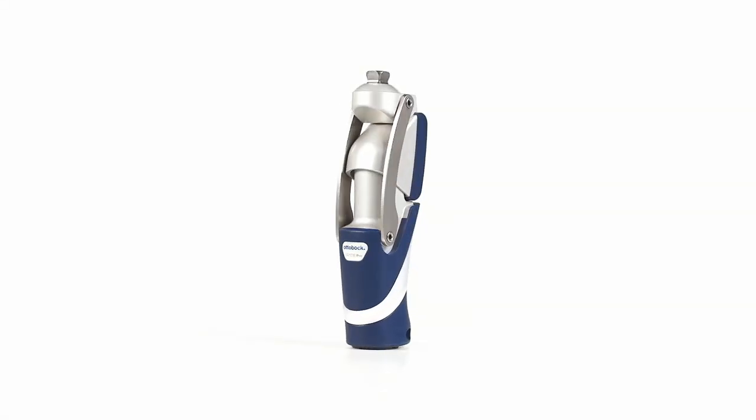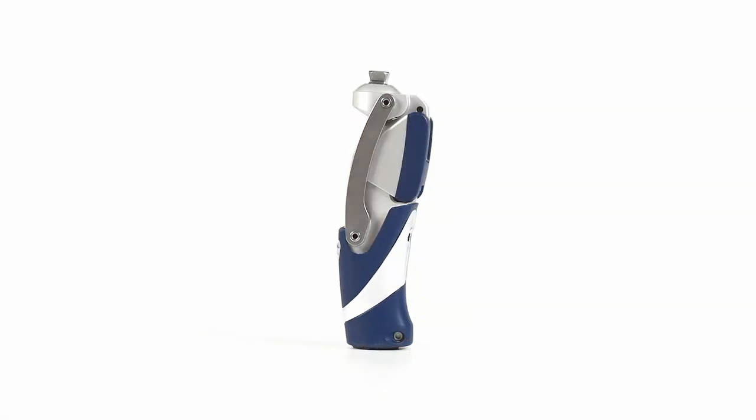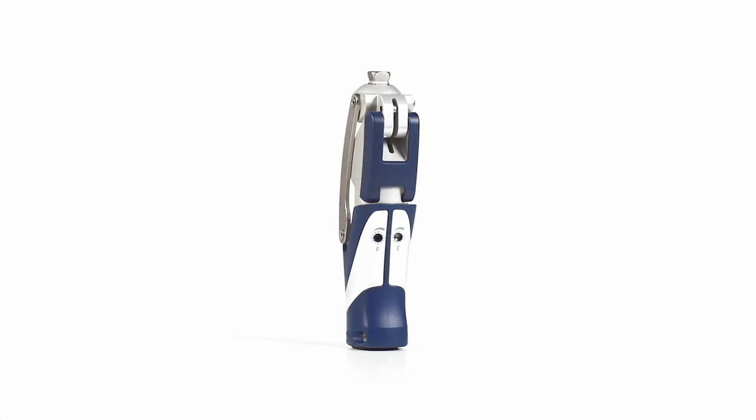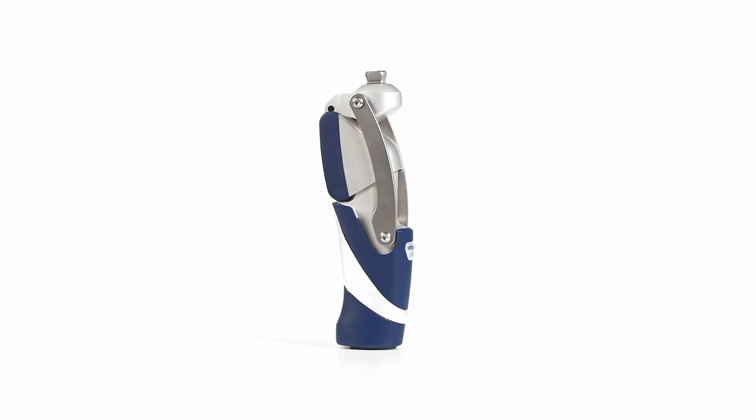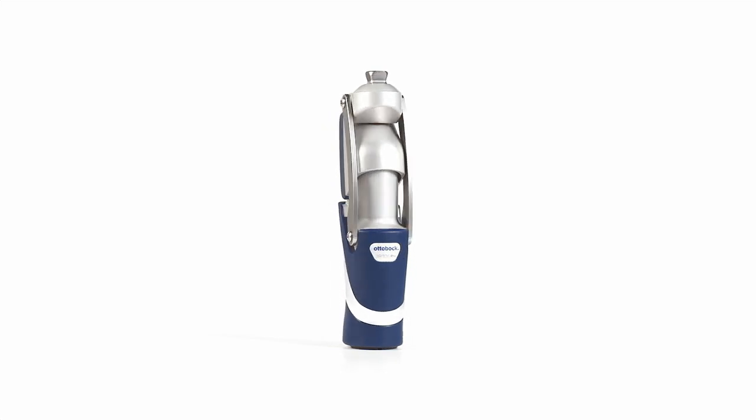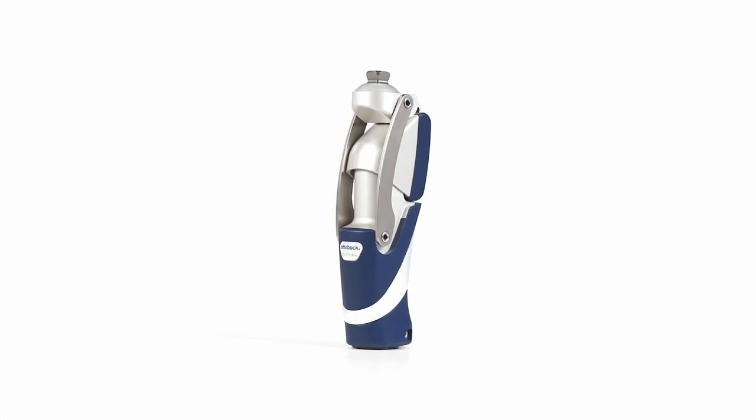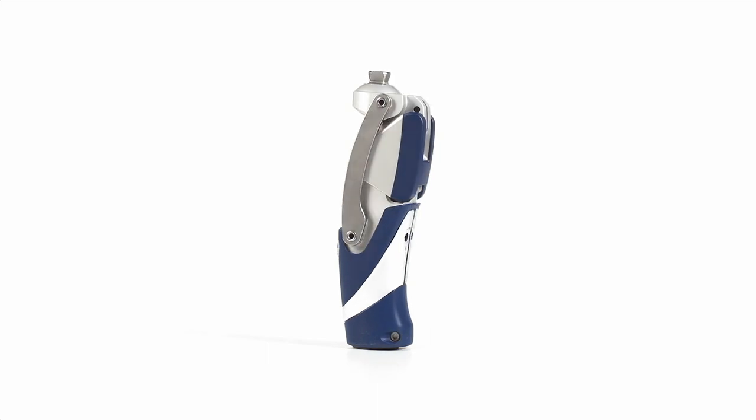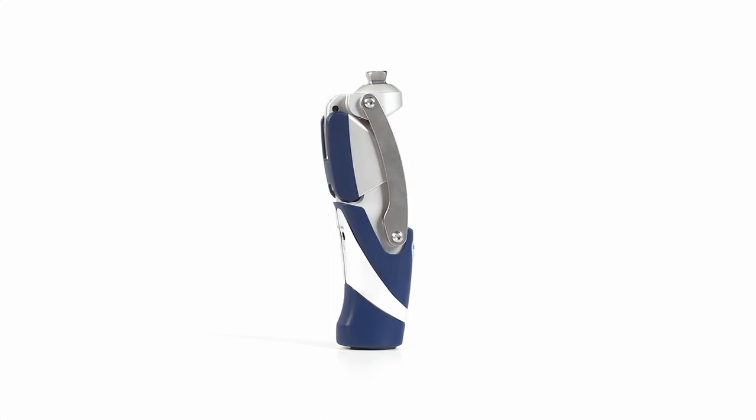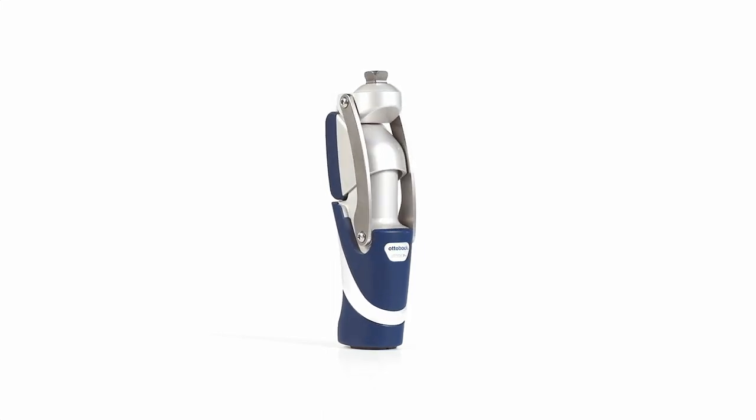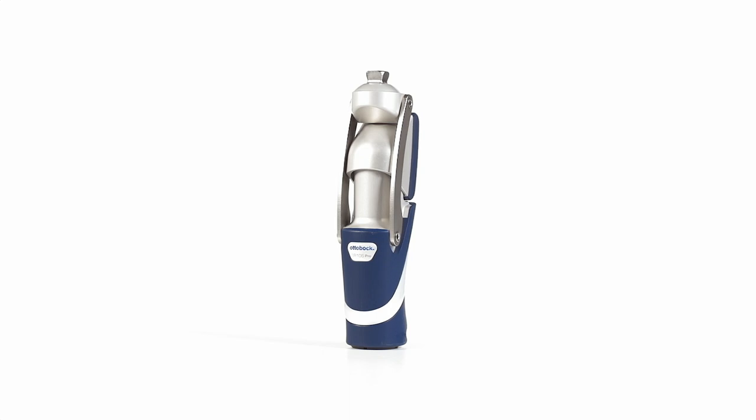The key element of the polycentric prosthetic knee joint 3R106 Pro is the servo pneumatic control unit. Pre-adjusted to normal walking speeds by the O&P professional, the powerful dual chamber pneumatic unit with progressive damping properties controls the heel rise depending on the walking speed. This leads to a harmonious gait pattern even at a more rapid pace.